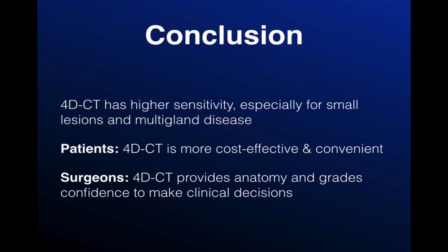But if we're looking at all of the data and other factors, 4D-CT has high sensitivity for sure, especially for small lesions and multi-gland disease. From the patient's perspective, it is more cost-effective to do 4D-CT rather than scintigraphy, and it's also more convenient. And then from the surgeon's perspective, it provides exquisite anatomy and helps grade confidence, allowing clinical decisions to be made.